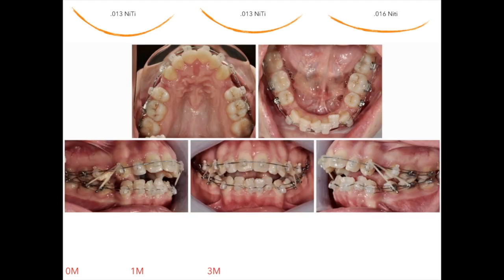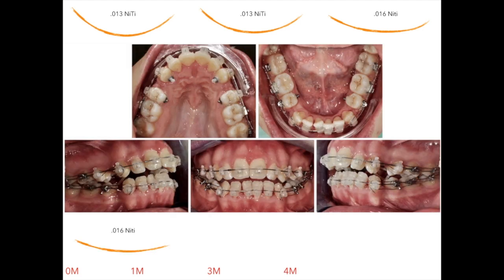At three months, we start using second-class elastics that medialize lower cuspids and distalize upper cuspids on a 0.016 CuNiTi wire. A month later, since too much torque is being lost on the lateral segments, I place palatal elastics, which express the same sagittal forces while also increasing the torque of the teeth they are applied to.